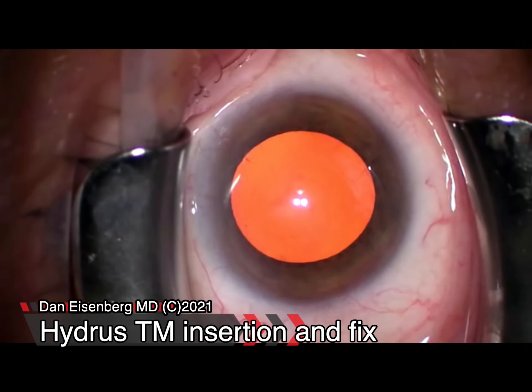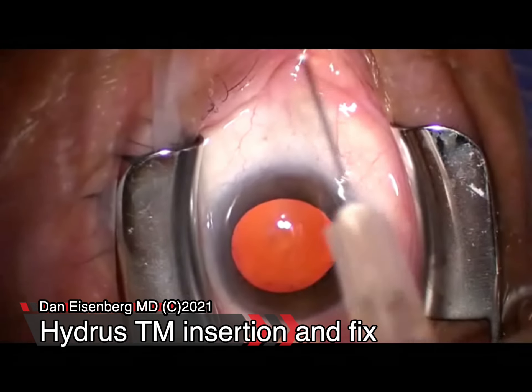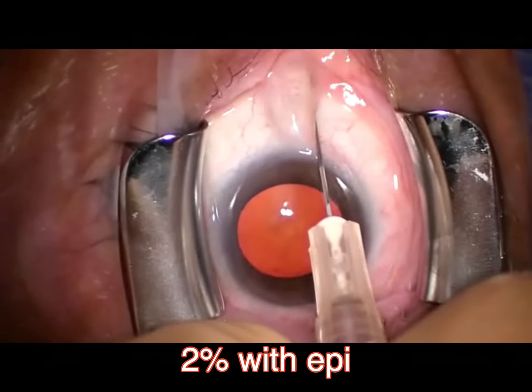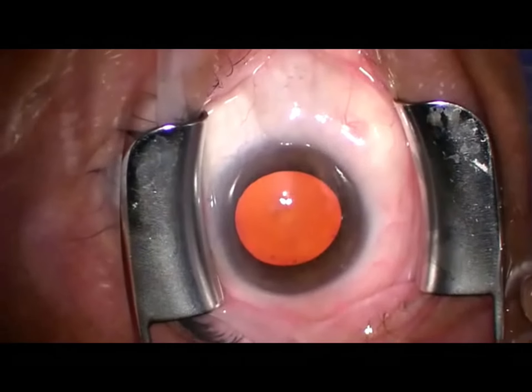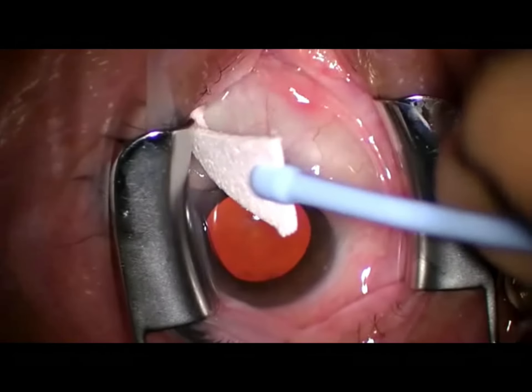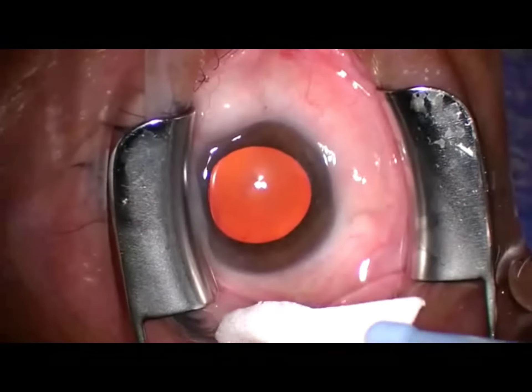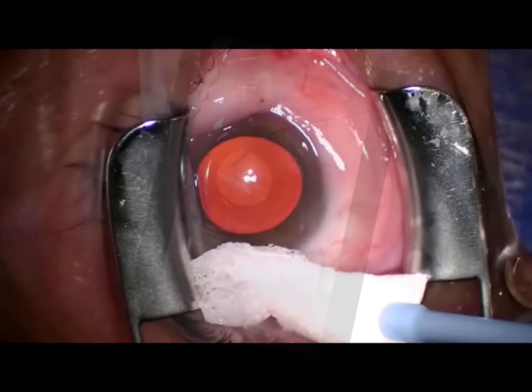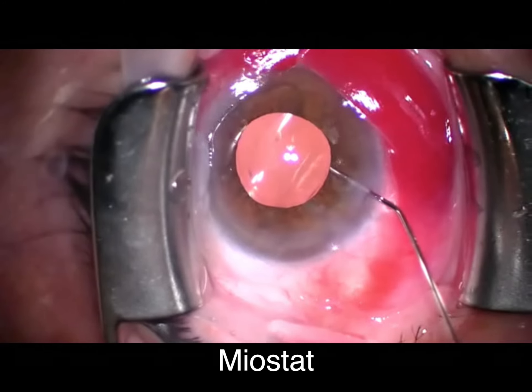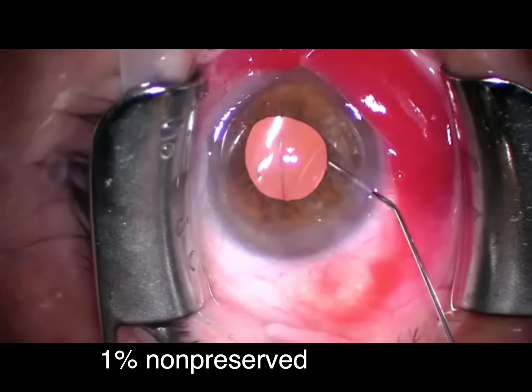Welcome, thank you for joining me. We've got another Hydrus malposition video — this is a trabecular meshwork install with recognition and repair. This is a not-uncommon but not-rare event with Hydrus. It is an XYZ procedure, so it's important that everything be lined up correctly. I've glossed over the cataract surgery portion here.